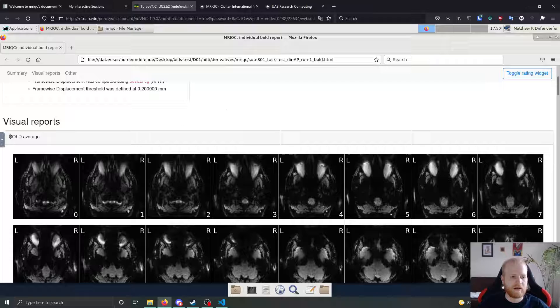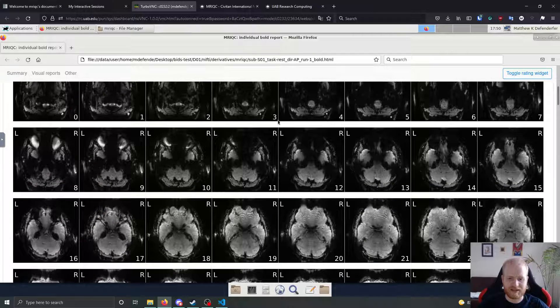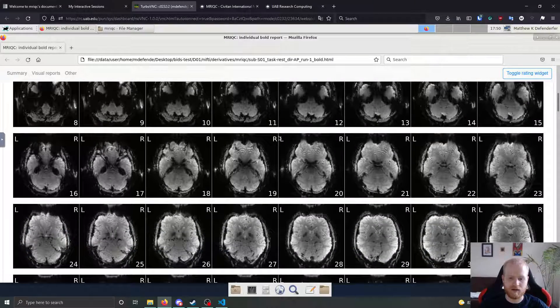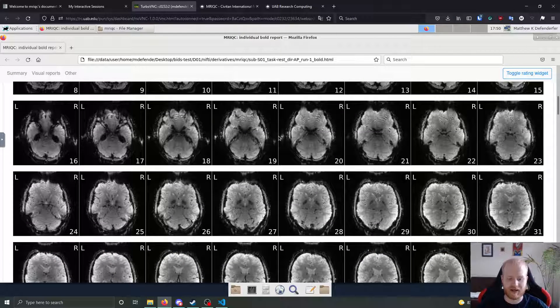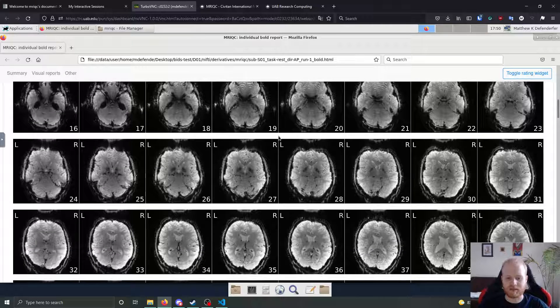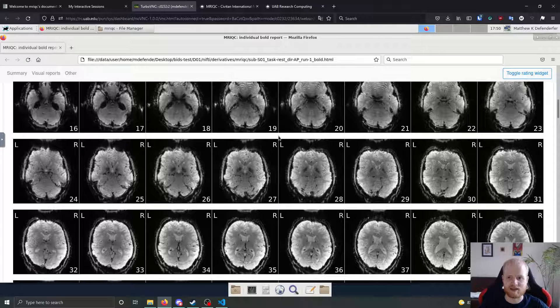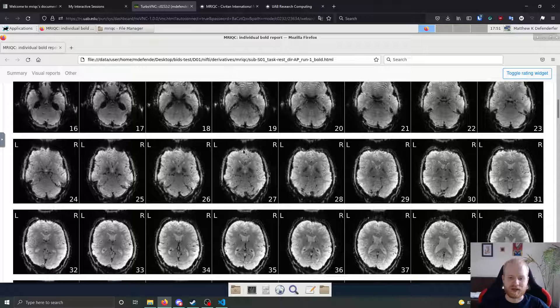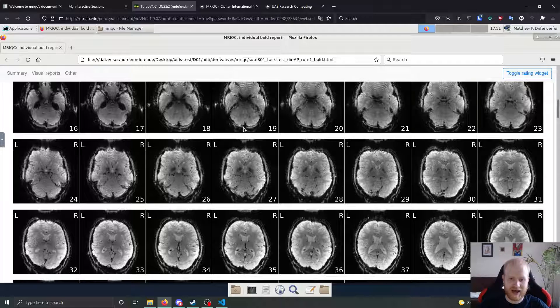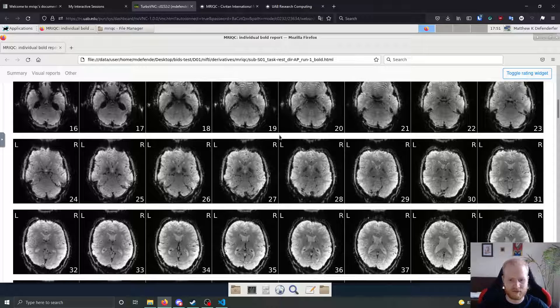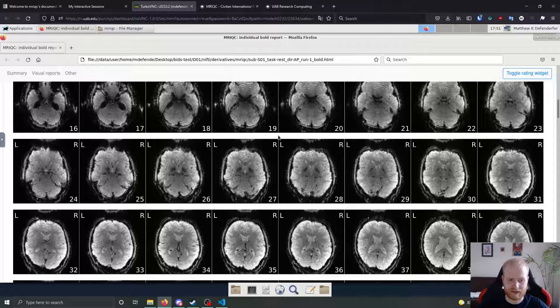And then for the visual reports, it gives you the bold average. So it's averaging all of the volumes together and presenting them as the slices through that average. And just remember, as you're looking at this bold image, these images are not pre-processed, so there's been no distortion correction on them. So for this AP image, as you're looking at the front here and you see this weird smushing at the front and extension at the back, this is an AP image. So that's completely normal. You shouldn't mark an image as being bad for having that since they are uncorrected as of now.